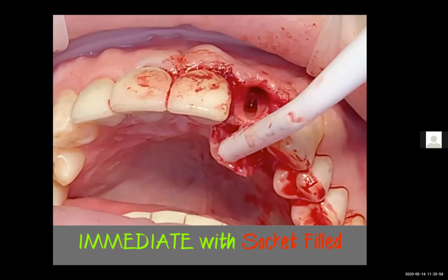Tooth number 10 had a metal ceramic crown with a cast post and core, and because of occlusal trauma and a vertical root fracture, the tooth was non-restorable. I hope this video can help answer any questions you might have up to now. I'm going to apologize ahead of time for the discoloration of the video during the grafting procedure, because my assistant accidentally put the overhead light onto the surgical film. So let's watch the video.